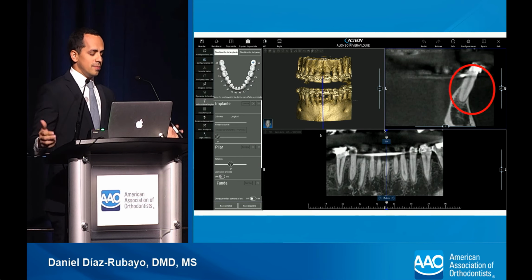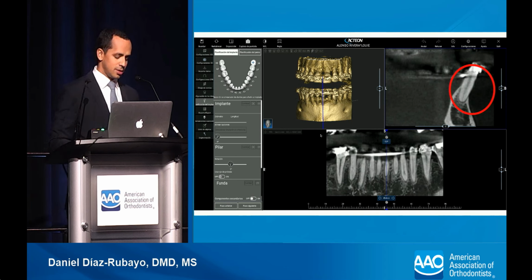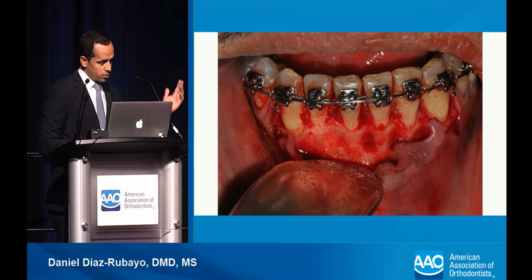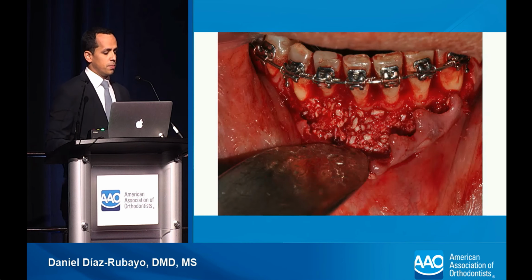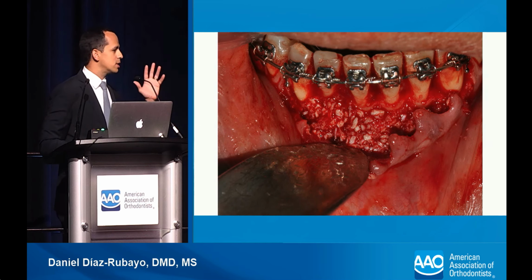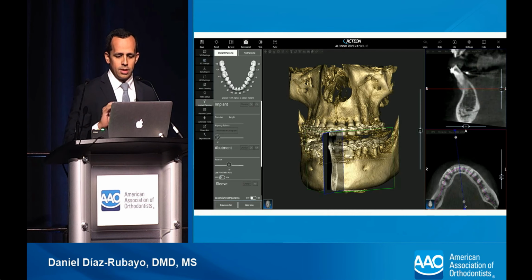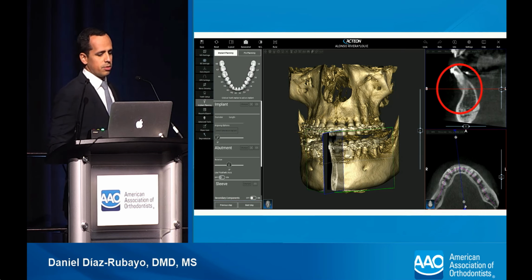So he finally built up the courage to go to Dr. Herrero's office and get the procedure done. And she opens a flap. These pictures are courtesy of hers. She does the corticotomies, places the graft, and I told her, please place a lot of bone, like a lot of bone. And even when you see it's a lot, just put more. So she did, and sutured up, took a post-op cone beam where we can see the graft that was placed.